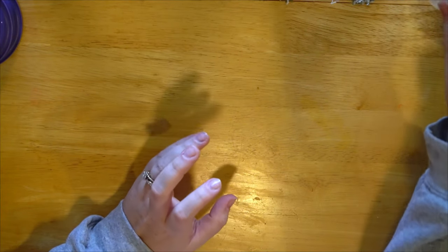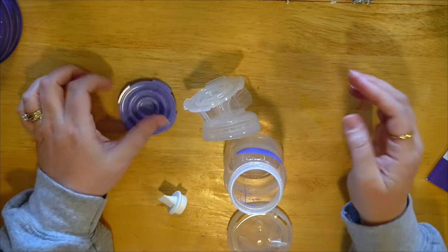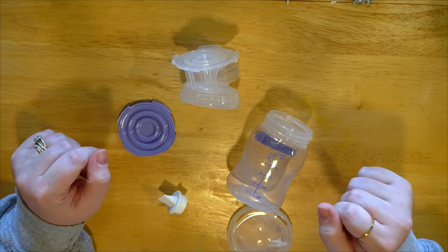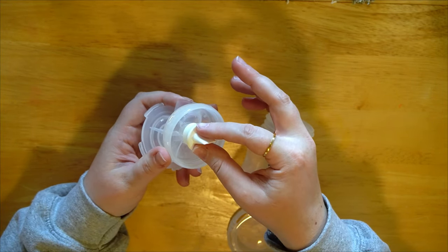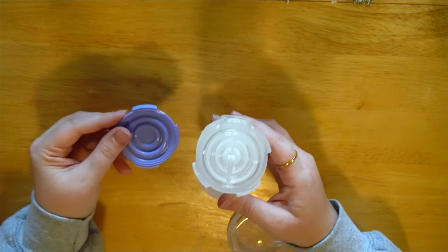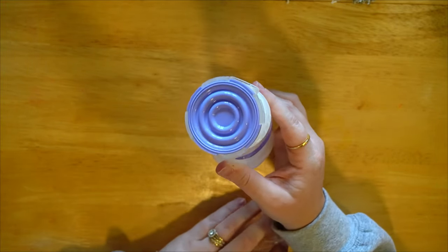I'm going to show you how to assemble your pump parts. One of the easiest things to start with is the duckbill valve — you just want to push it on the base and make sure it's as flush as it can be. Then you can go ahead and screw your bottle on. Take the purple pieces — they've got notches so it's really easy — and the manual did a great job of walking you through this as well. Make sure it's sitting flush and the notches are where they belong.